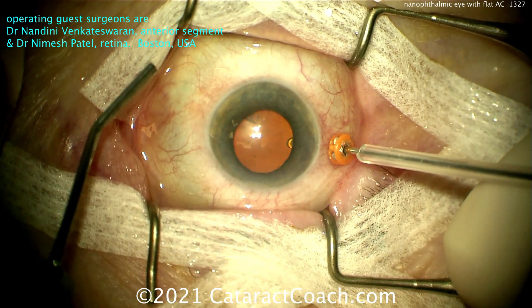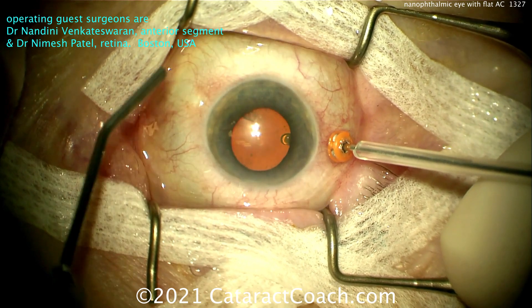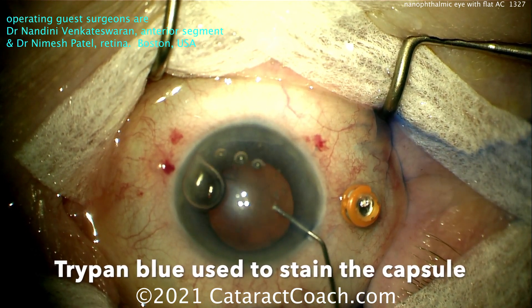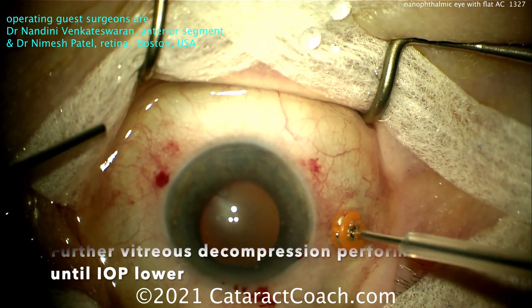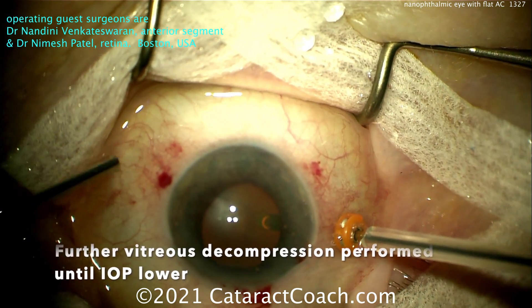First, they're doing a vitreous decompression, just a little bit at a time. Look at the trocar — such a smart idea, putting that sleeve on top of the vitrector so you don't go too deep in the vitreous cavity. A little trypan blue dye going in there. Just check and make sure it's normal pressure. You can do a little bit at a time — a little bit of vitreous decompression to help lower the IOP to get it where you want.